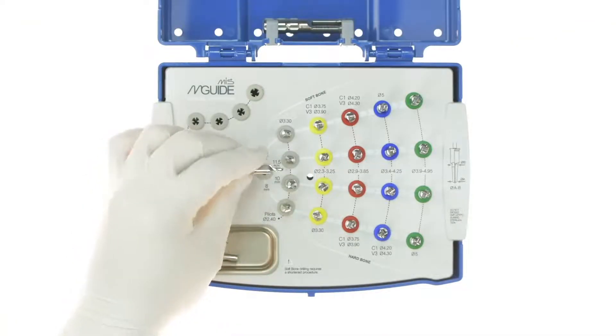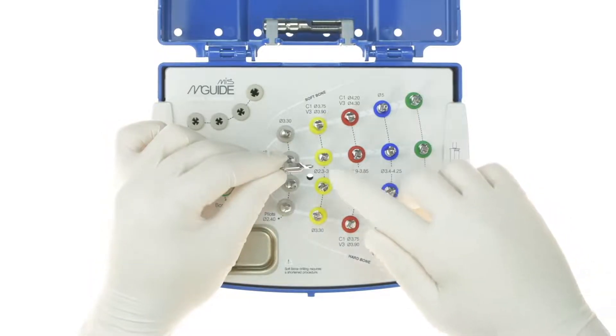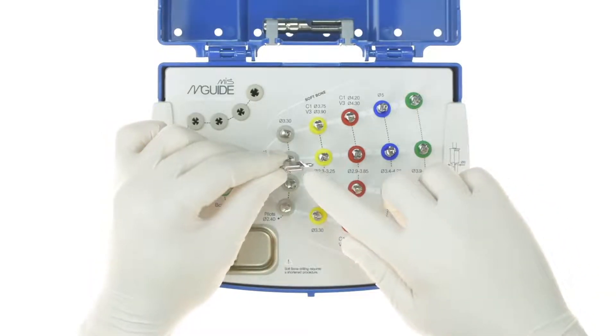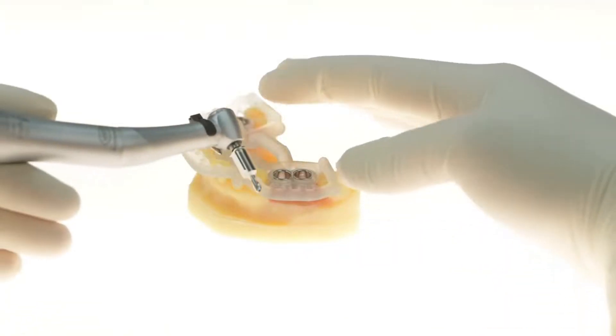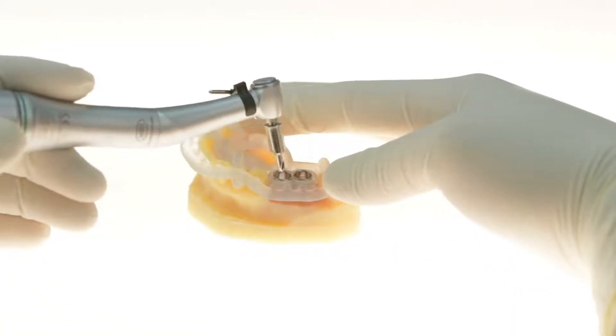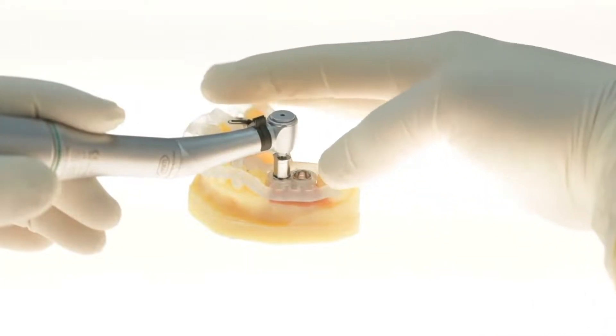After the site has been prepared, we can initiate the osteotomy with the starter drill. All tools and drills must engage the metal sleeve of the M-Guide before turning on the drill. The starter drill is designed so that the tip of the drill comes into contact with bone only after the body of the drill engages the sleeve and centers itself.